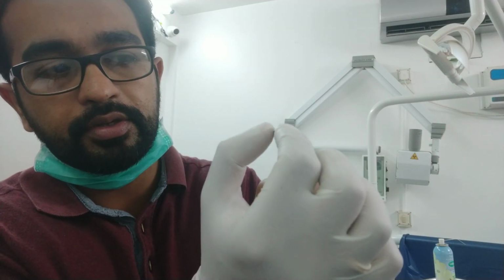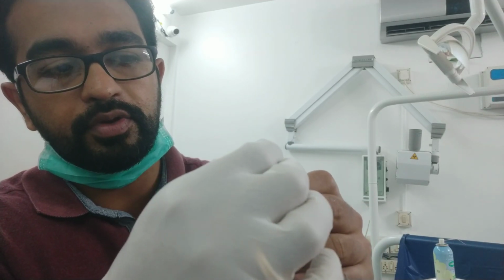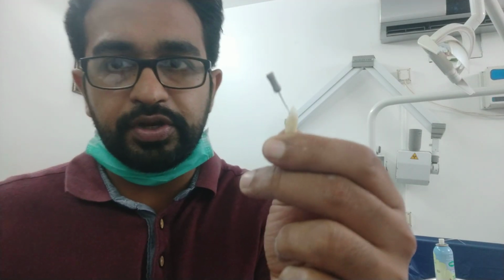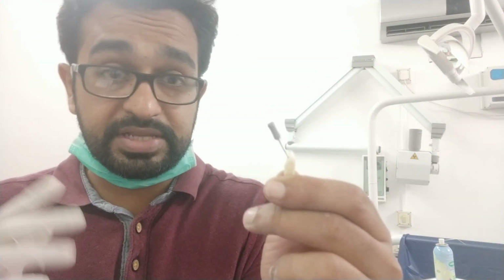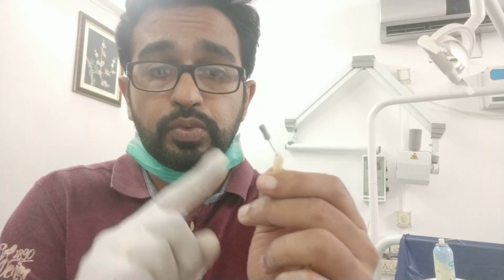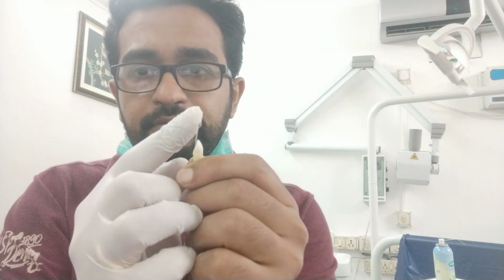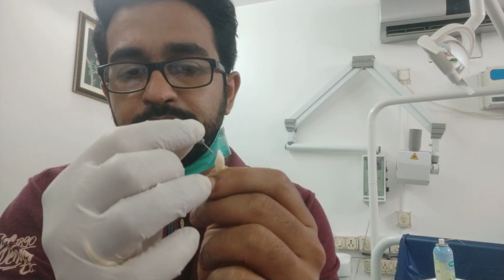See, it went inside the canal completely, right? If I do it in a watch winding motion. Now you see the angulation. This will be the same in the patient, right? This should not be the angle with which you are putting the file inside the tooth. This should not be the angle. The angle should be straight. Your file should be straight. So how to make it straight?